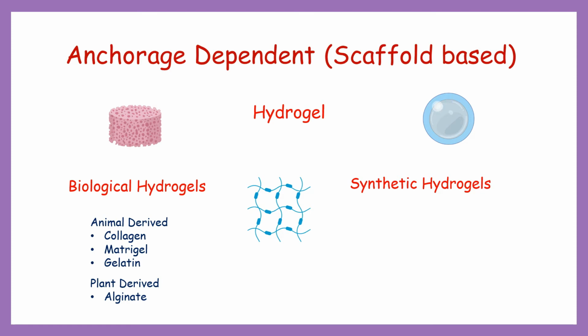When well designed, synthetic hydrogels are ideal materials to use as 3D cell culture scaffolds as they can mimic biological properties of ECM and be functionalized with defined adhesive moieties that include proteolytic sites and encapsulate growth factors. At the same time, they are chemically and physically well defined and often have tunable mechanical properties to achieve a desired stiffness or porosity. Synthetic hydrogels can be categorized into non-natural and natural polymers.